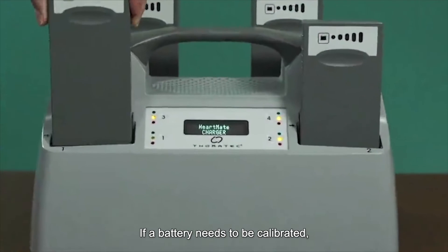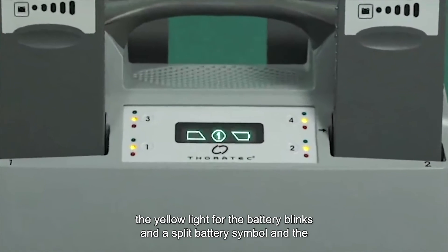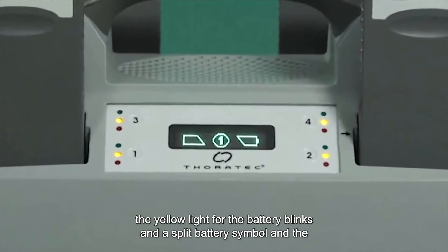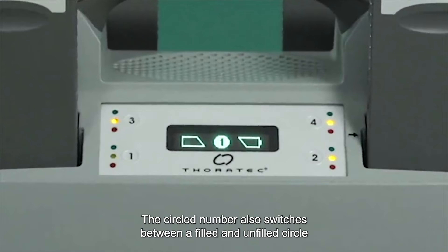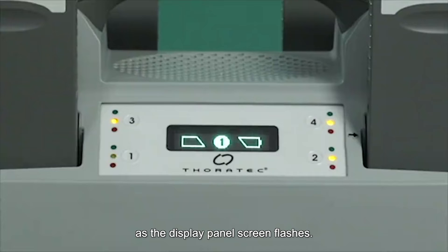If a battery needs to be calibrated, the yellow light for the battery blinks and a split battery symbol and the pocket number flash on the display screen. The circled number also switches between a filled and unfilled circle as the display panel screen flashes.